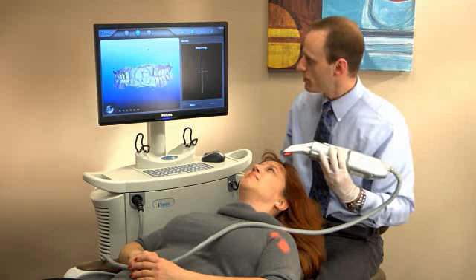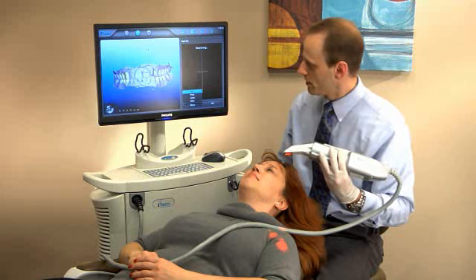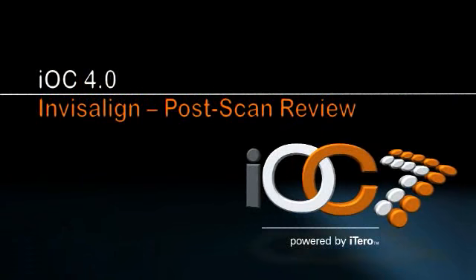Okay, now that I'm done with the right side, I'll press menu, and I'm going to enter the view tool. Once your Invisalign scans have been processed, you'll need to review the model and fill in any missing areas using the Add Scans function.